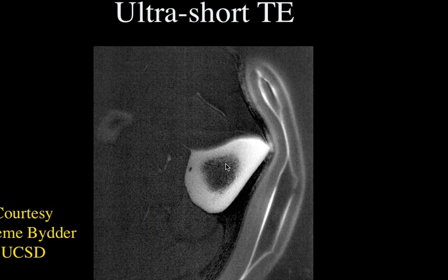You can do much faster imaging with much higher gradients and RF and so forth on the knee if you just use a localized knee coil. Because if you do that kind of imaging with the body coil, you can't do it, because you heat the body too much.